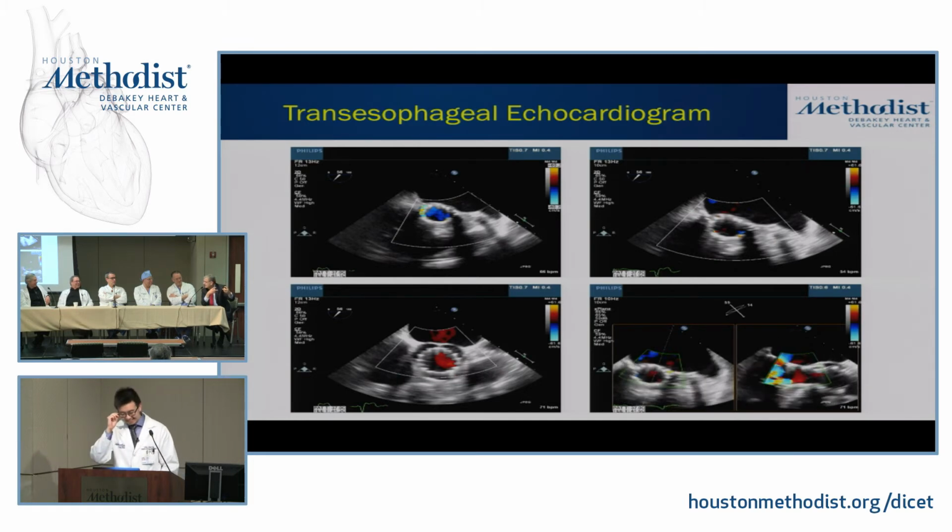So the recommendations that will be coming out in a year is you have to scan it from top, gradually all the way to the bottom, and find the start of this aortic regurgitation. So you have to do a full, judicious scan for you to be able to see it.